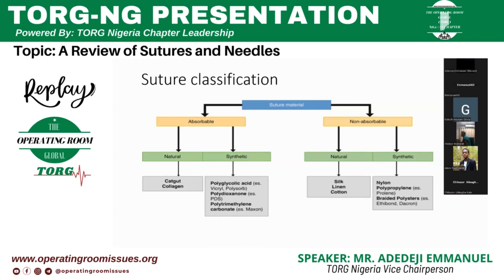So because of the use of chromic catgut, it was discovered that most patients come down with adhesions, and of course the complication is a risk in itself. For example, a patient coming for cesarean section the first time, the second time, and by the time you go back there the third time, you cannot differentiate between the anterior wall of the uterus and the wall of the bladder.